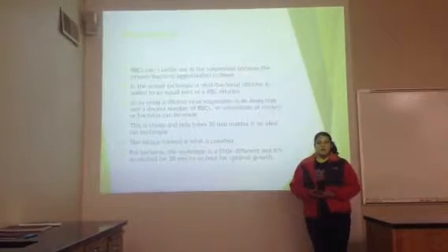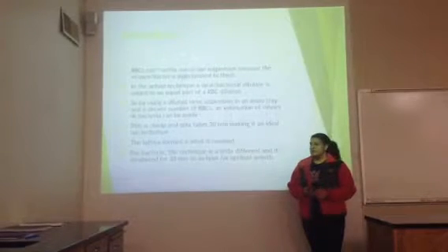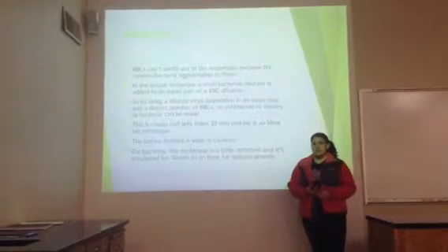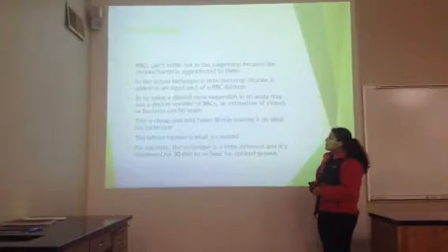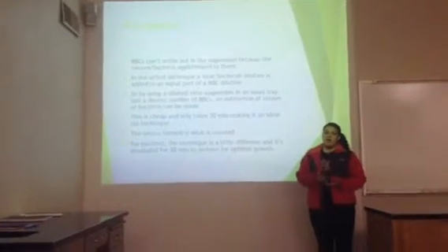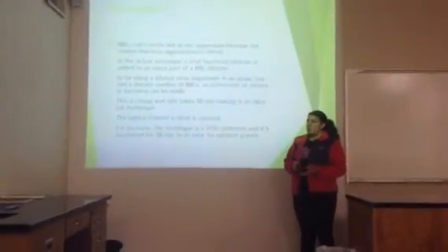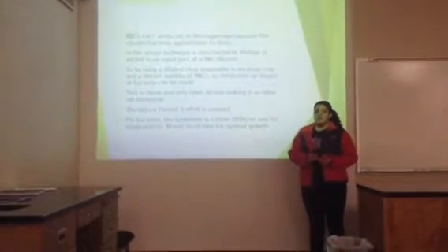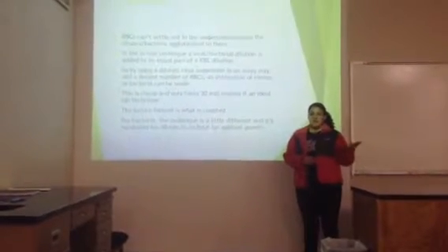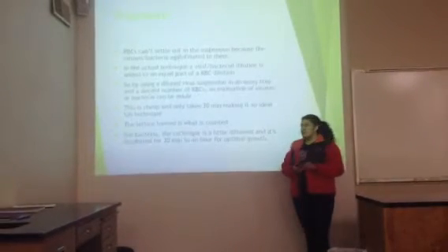It could be less, it could be more, it depends on what's being run, and on a lot of things such as pH. So usually it's an equal amount of viral or bacterial dilution to red blood cell dilution, and it gives a good estimation, not necessarily of how many, but of the presence of viruses or bacteria.